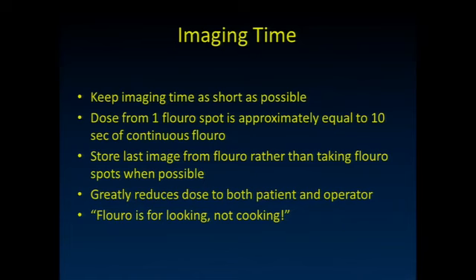In today's systems where that last image hold stays up, if you're just not sure about something, but you need to look at an image for a little while to see what's going on, and it's not a dynamic thing, just get your foot off the pedal and look at that image and learn that. Getting your imaging time down will really be one of the best things that you can do in terms of keeping the dose as low as possible during fluoroscopy. And I think that's it.